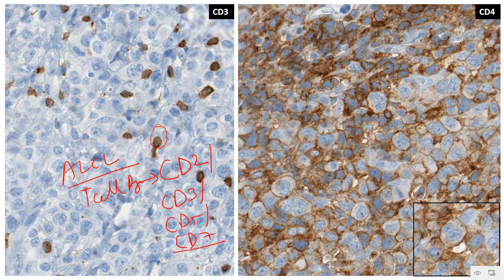So if you utilize three or four of these markers, you will see that a tumor which is of the mature T cell lineage ideally should express all these markers, right? But in these cases of anaplastic large cell lymphoma and even in PTCL, they will drop random antigens. So sometimes you will have no expression for CD3, but within the same tumor, you will have strong expression of CD4. Okay, so this kind of heterogeneity as far as the expression of mature T cell antigen is concerned is an important hallmark of anaplastic large cell lymphoma.